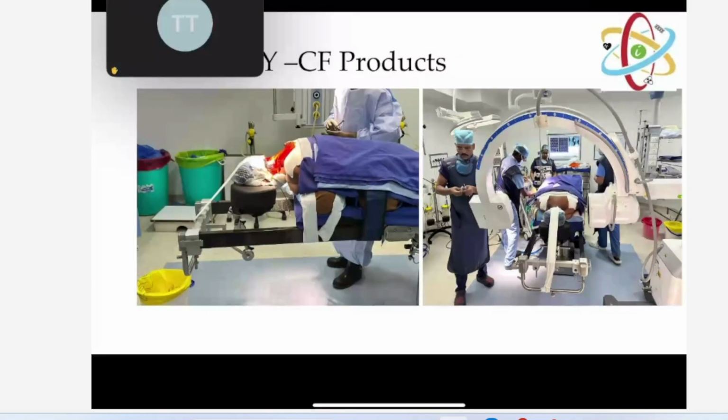You can extubate the patient from that machine. I can send the patient to ICU and he never comes back with any complaint about his surgery, because the surgeon is able to see everything inside the operation theater itself. We don't even need to go for post-op imaging. We call it post-surgery imaging.